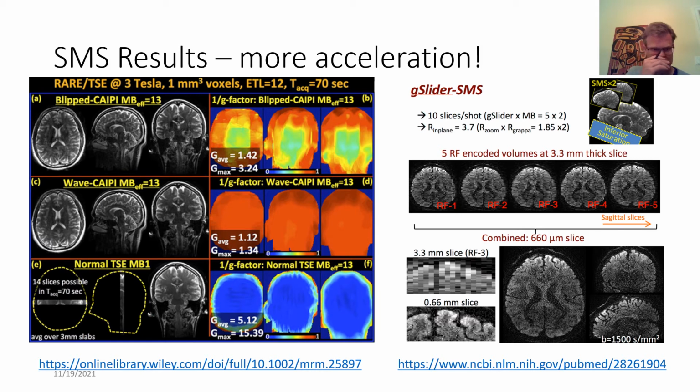And just some more nice looking results. This technique has been very successfully applied, and there's even this newer technique called wave CAIPI. Anyway, this is here for your viewing enjoyment and reference if you're interested to learn more.